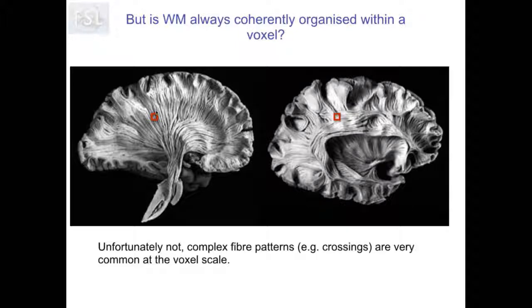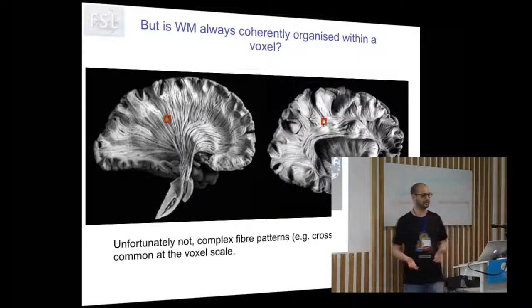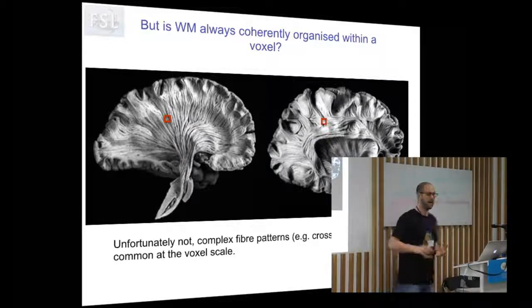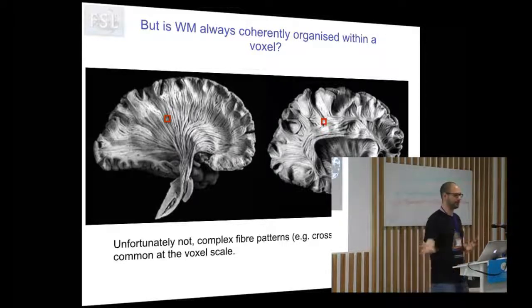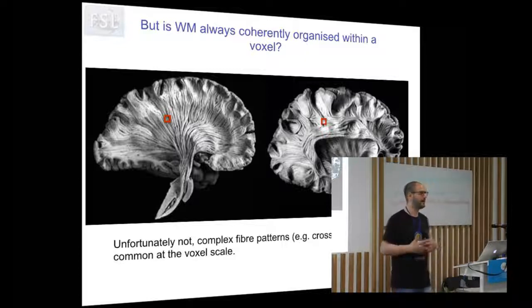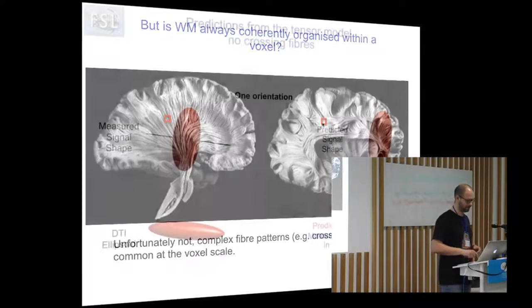So you have one densely packed bundle of axons nicely and coherently following the inferior to superior direction, so along the z-axis. If we take another voxel, like here, you see that now we start having intersections of two different fiber populations, right? Fiber population projecting to the superior gyrus there, and the fibers of the so-called superior longitudinal fasciculus following, well, the Y orientation, right? So to the anterior, to the posterior part of the brain. So what we have actually is that given our millimeter resolution, we have to find a way to deal with these complex subvoxel fiber configurations, right?